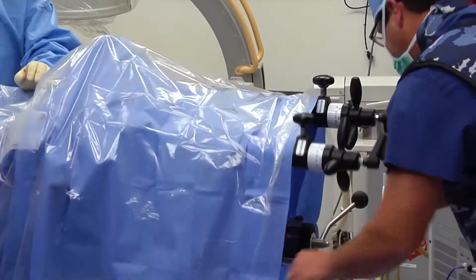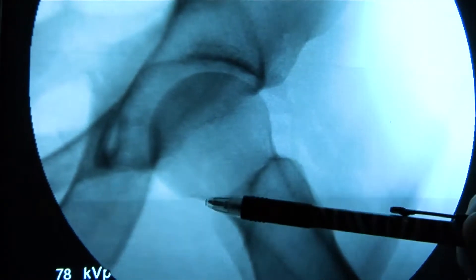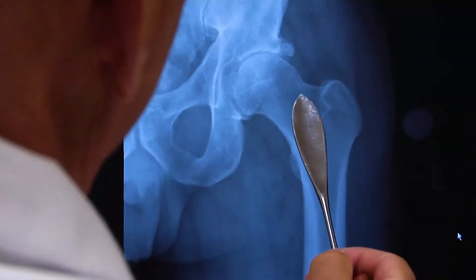Hip arthroscopy is basically putting a camera inside of a joint instead of having to cut the joint open with a big incision and spreading the muscles apart to get there. We can make a few tiny poke holes and go in with cameras and instruments to treat the tissue in there that's injured.